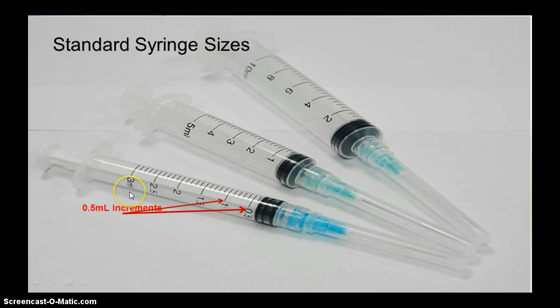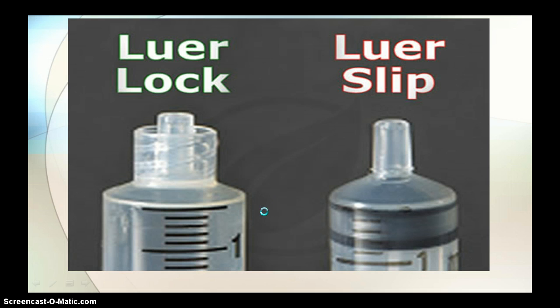The one you'll see most often is a 2 to a 3 mil syringe, and you can see where the increments are on here. Very important that you know and understand these increments, because you'll be using those when you draw up meds. And you can see the difference here: 1 mil, 2 mil, and you can see if I wanted to do something much more tightly controlled, I would be using a 3 mil syringe here, and you can see those increments in 0.5.